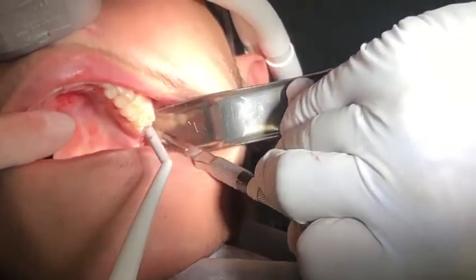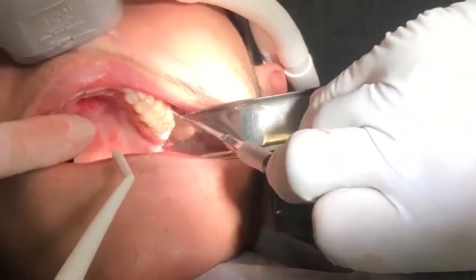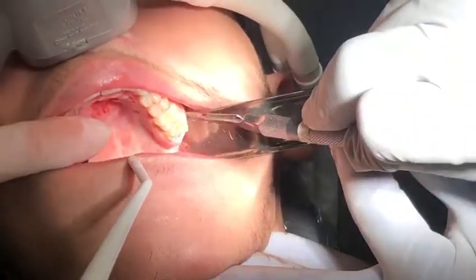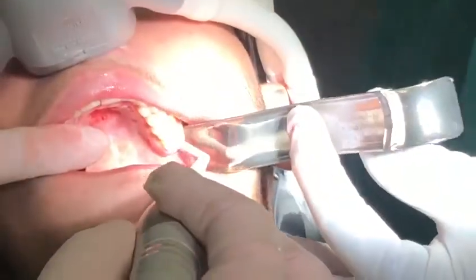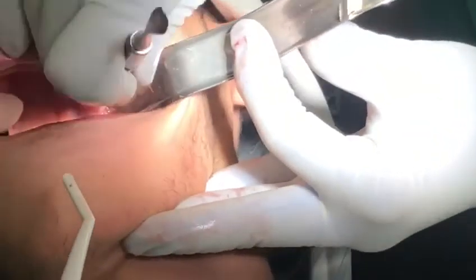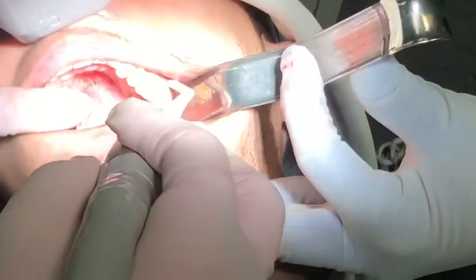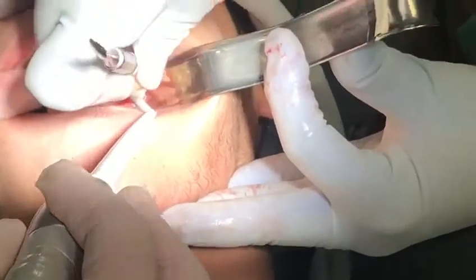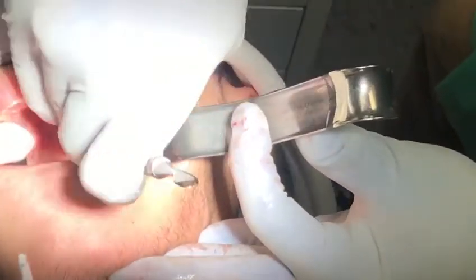Nice. We can go one more time around there, a little bit of pressure, a little pushing. Let's see our tooth hiding — pressure, lots of pushing around the gums.